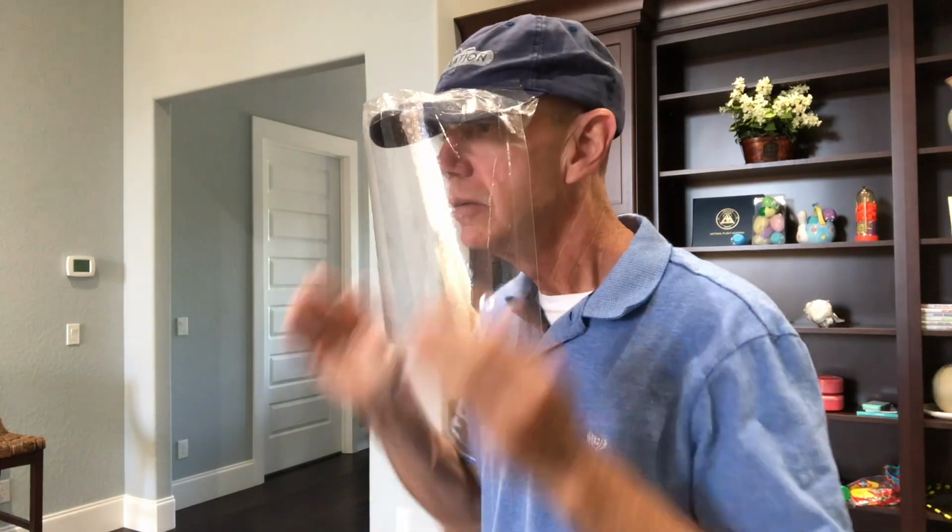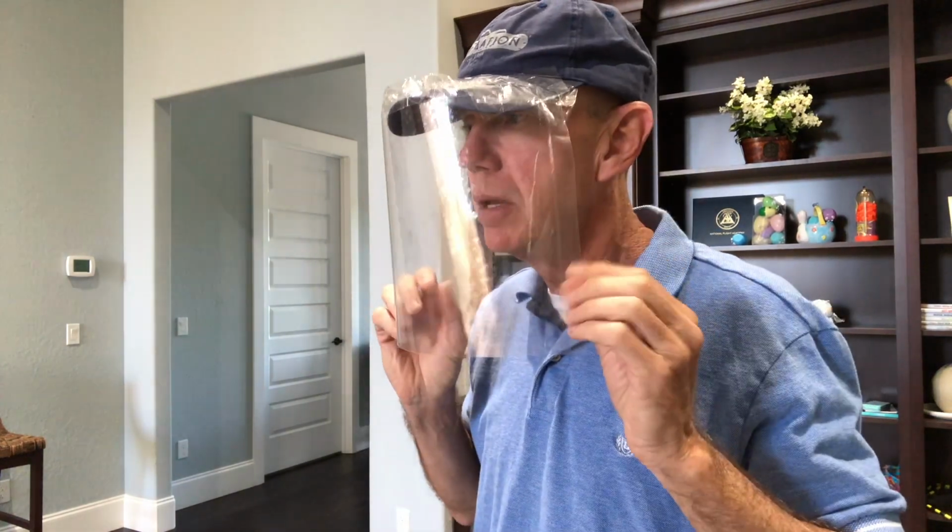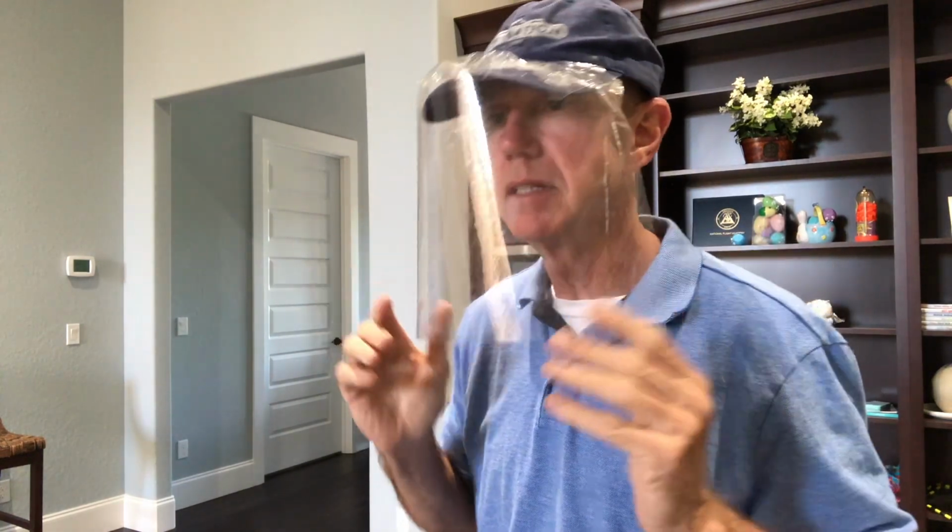Well, what do you think? I would have liked it to come a little bit farther back, but not too bad. You remember I got that mark on it over here. It doesn't seem to interfere with the vision. I do have quite a bit of bubbles. The next one hopefully will be better.